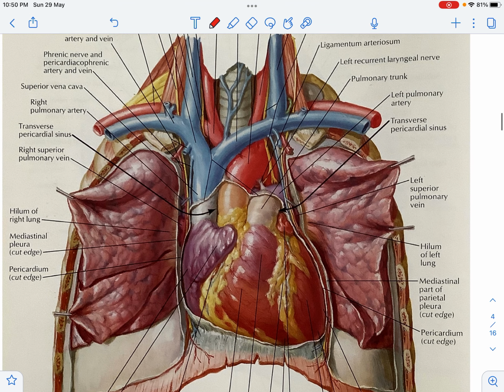So now let us look at this diagram from Netter's. So this is our venous cannula. You have the two-stage venous cannula. It is sitting like this. This is the end hole. I'm sorry, I'll draw it a bit longer. The end holes, this is going to receive blood from the inferior vena cava. This is the superior vena cava over here, and here is the inferior vena cava.